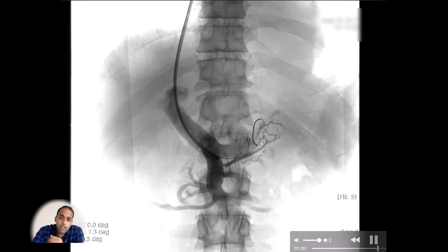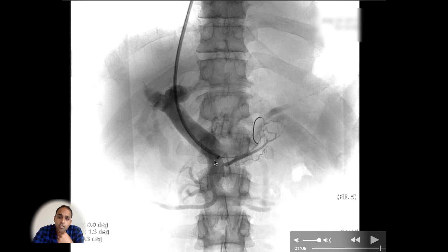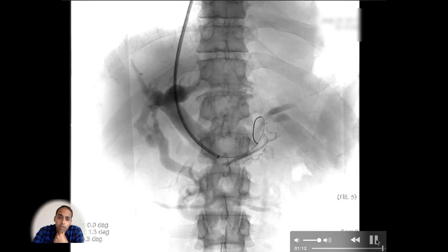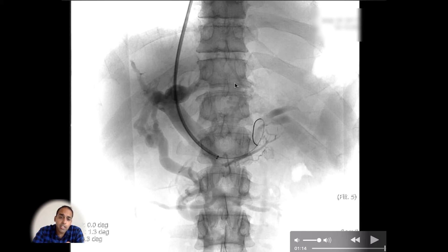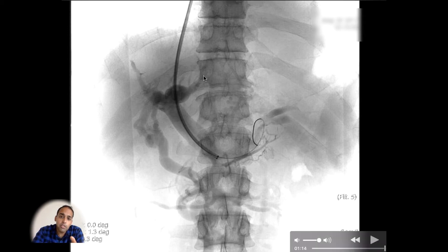This is what's called a direct portogram. Again, we have that 10-French sheath. This is a Lunderquist wire — the stiffest wire out there — with its tip coiled up in the splenic vein. We're injecting contrast through the sheath and getting a direct study of the portal vein. We're seeing many of the same things as on the CO2 portogram. The intrahepatic portal veins have a truncated appearance because they've narrowed from chronic portal hypertension from the cirrhosis. Since flow can't enter the liver, these veins have narrowed and flow is being diverted into the varix — again, that recanalized umbilical vein.